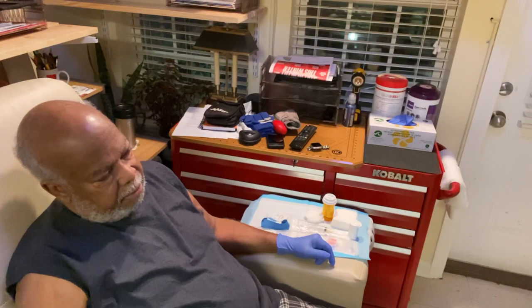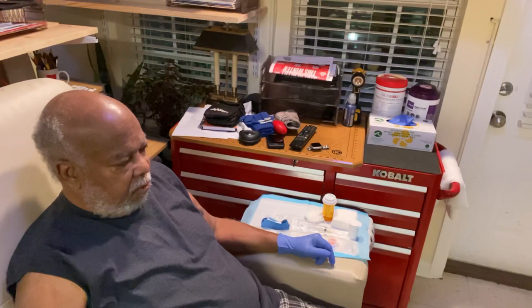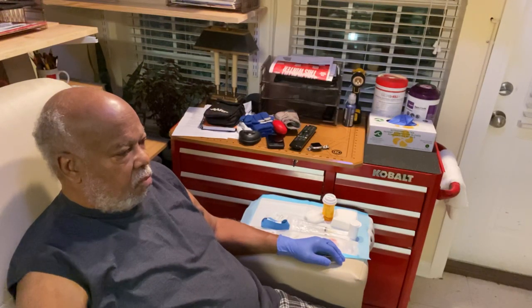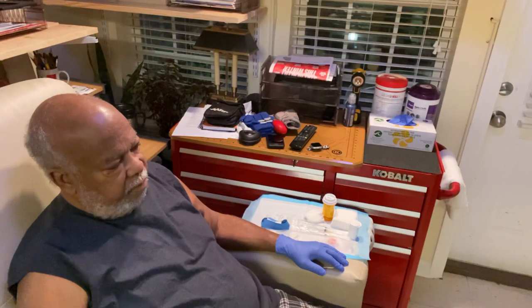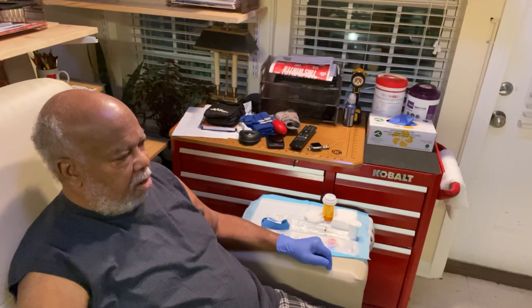Thanks to my ever-so-loving care partner, Elaine Hughes, better known as Wifey, we are going to do our best to present to you what this is all about. In the first video we produced, we showed what's involved in setting up the machine. Now we will show you what's involved in preparing the axis for treatment.